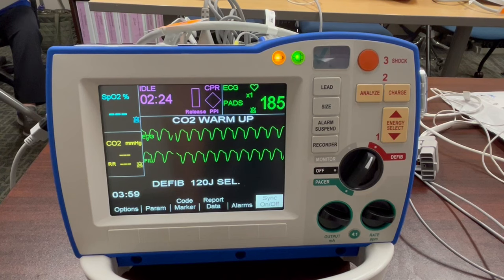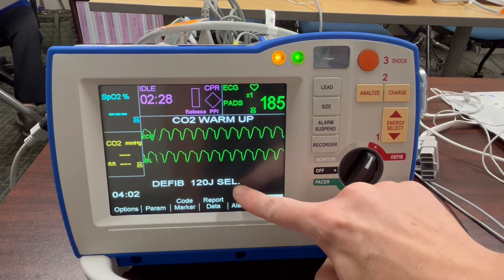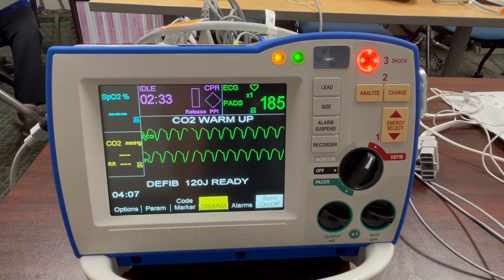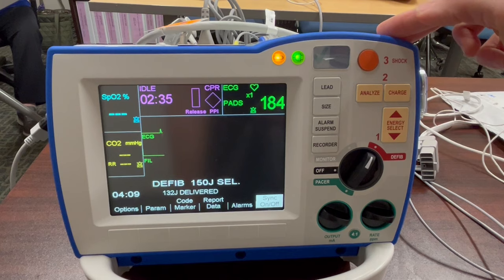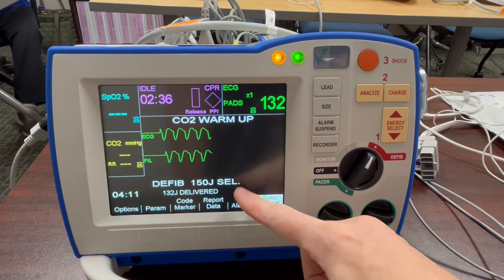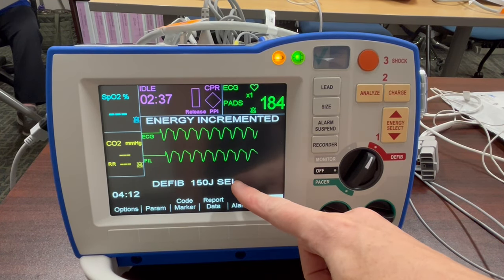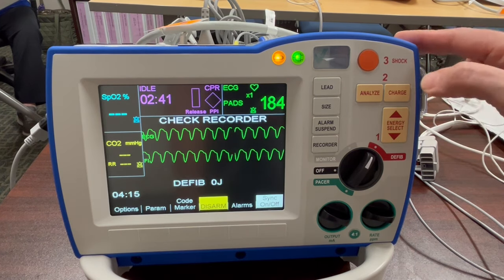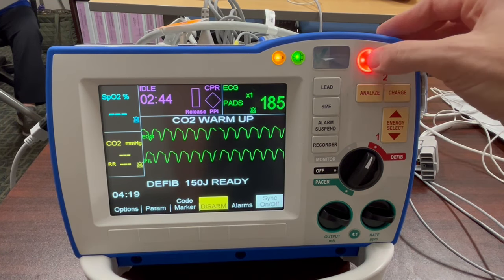In the case where you need to shock a patient, turn the monitor onto defib setting. The monitor will default to 120 joules, which is the recommended joules on this device for the first shock. After the initial shock is delivered, the joules automatically increase — for example from 120 to 150 — and will continue increasing up to a maximum of 200 joules.